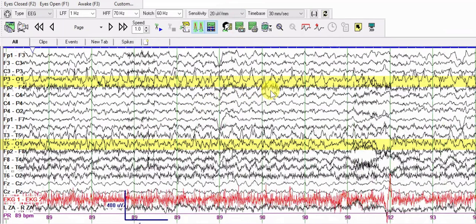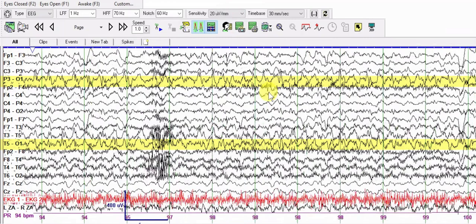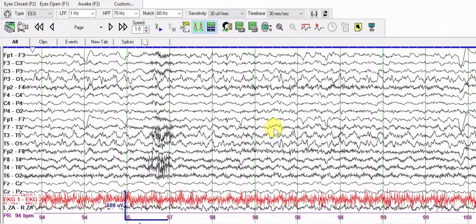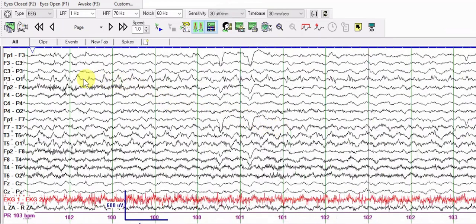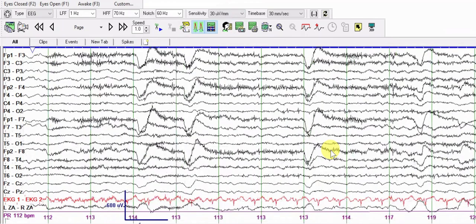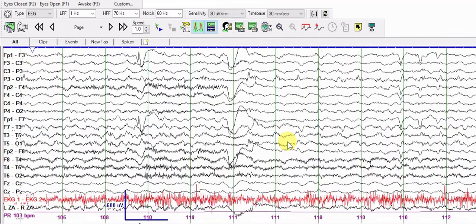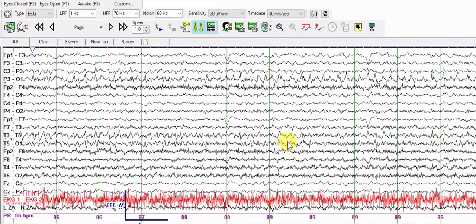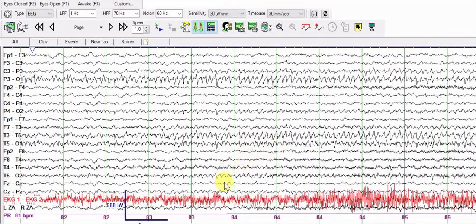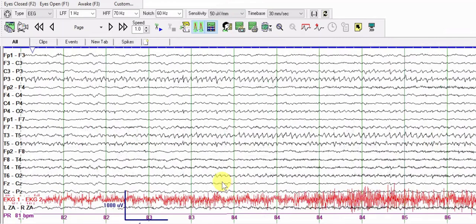The activity starts slowing down and involves more channels — you're seeing a lot of rhythmic activity. Even at 30 microvolts per millimeter it is still visible. The sharp waves remain and then the rhythmic delta activity disappears. This was an electrographic seizure originating from the left occipital head region. The seizure spread to the frontal eye fields and the patient had a head deviation to the right side.